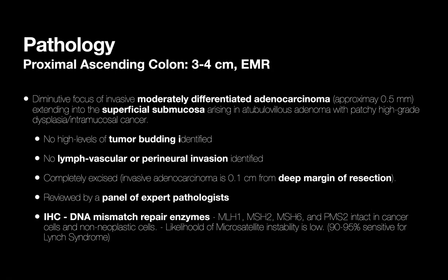I would just want to make sure that they have done special staining to make sure that there is no lymphatic involvement. That one gland that you showed us, initially I was saying, well, is this inside a lymphatic or not? But I trusted that all of you have refuted and then decided that it's not inside a lymphatics.